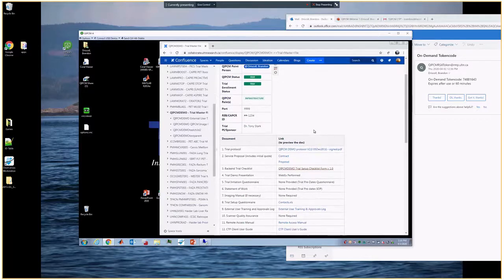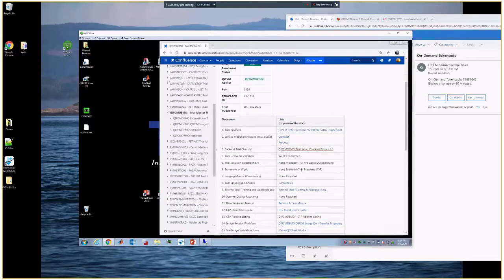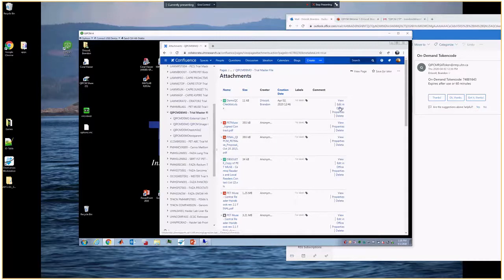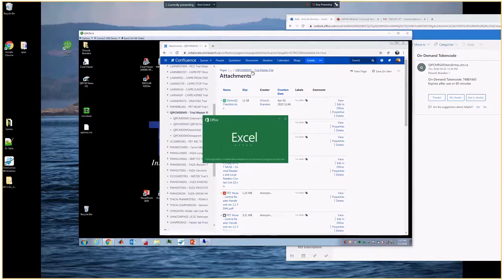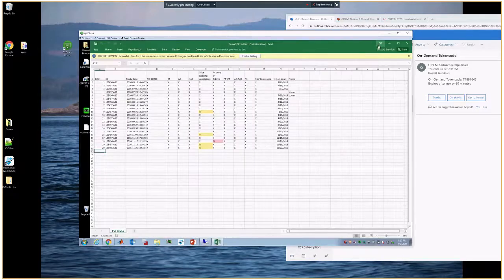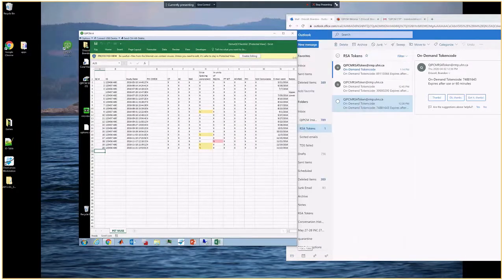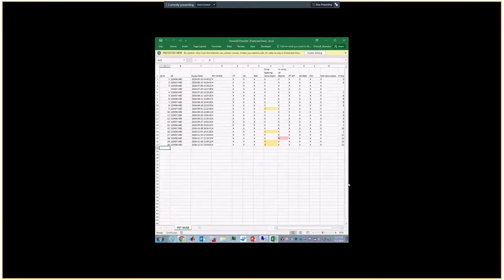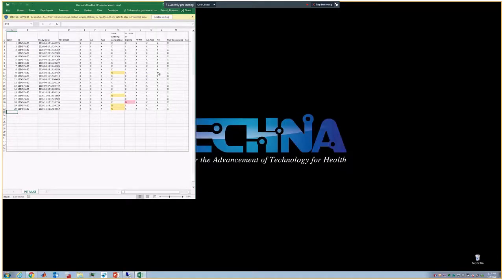In our demo one, we are going to have what is basically a QC checklist. This QC checklist is going to tell me what to go and look at when I'm QCing this image. So we'll have a spreadsheet something along the lines of this. Actually, I'm going to maximize this, make this a little easier for everyone to see. So this is our QC spreadsheet.